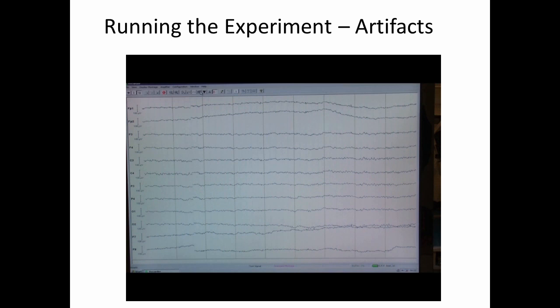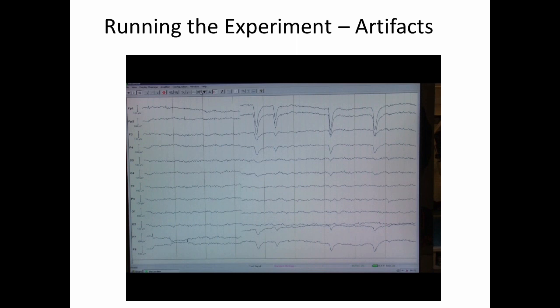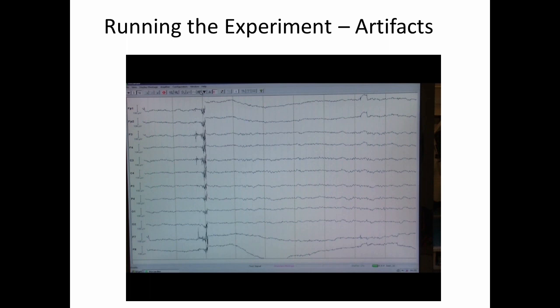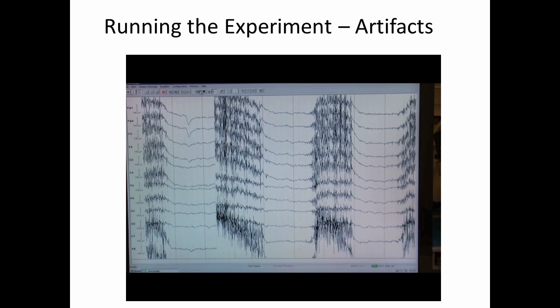In this video, you'll see some of the artifacts that we typically see in an experiment — these are things that we want to avoid during points of interest. Here you see some eye blinks, and you can see that it's a massive deflection that is substantially larger than the actual EEG signal that we're recording. We introduce moments in time when people can blink, so they're not doing it during the task. Here are examples of horizontal eye movements left and right — these are also much larger than the signal. And here you can see muscle artifact from the participant clenching their jaw — again, the signal here is much, much stronger than anything that we're actually interested in from the brain.